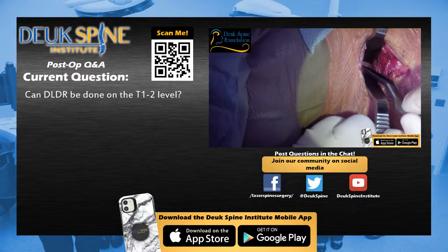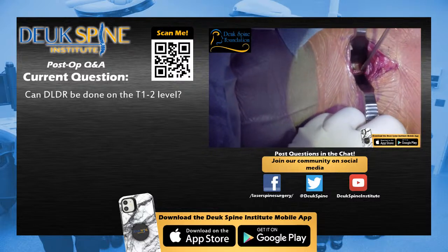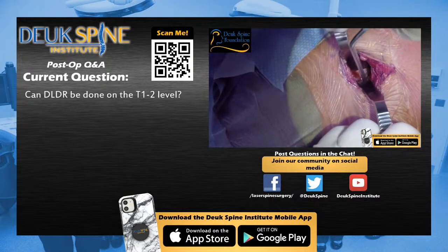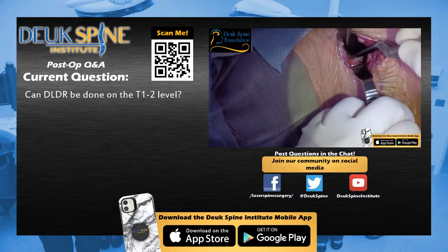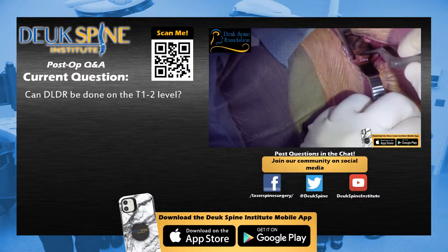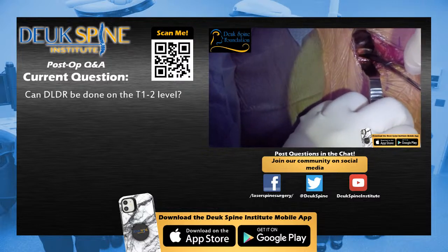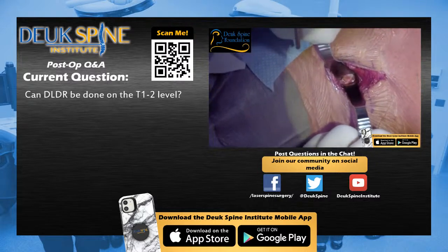It's interesting, though, many surgeons have not adopted it for reasons that probably it looks intimidating and technically difficult, and it is, but it's something that can be taught. So I believe that these worldwide 20,000 ACDFs done every year will be converted, 19,000 of them, or 95% of them will be converted eventually to anterior cervical endoscopic surgery, because there's no need for fusion, there's no need for metal, there's no need for bone graft, there's no need for open surgery. It's all done outpatient, and it's done with a 4-millimeter incision.